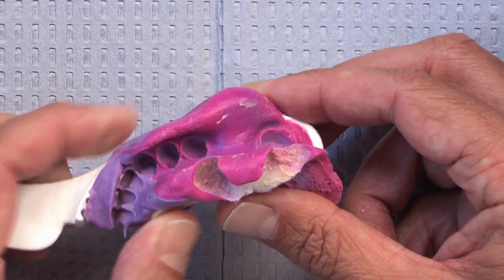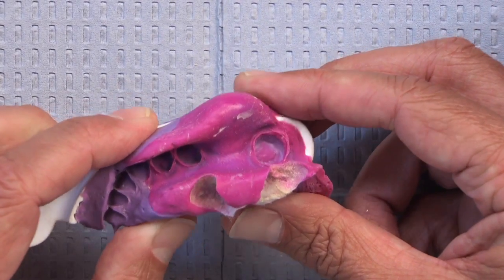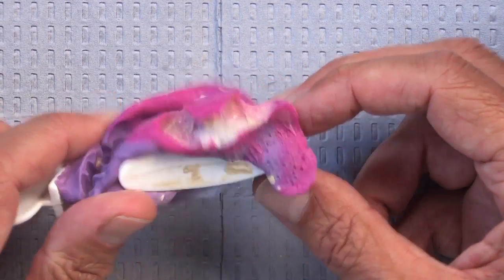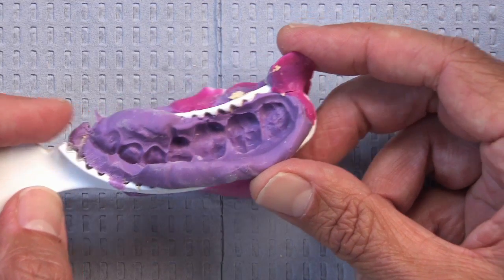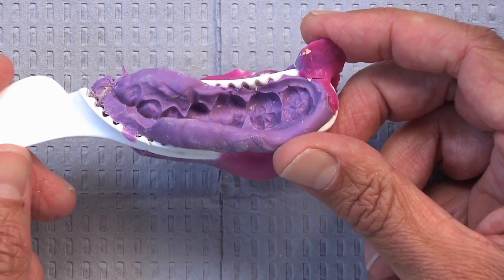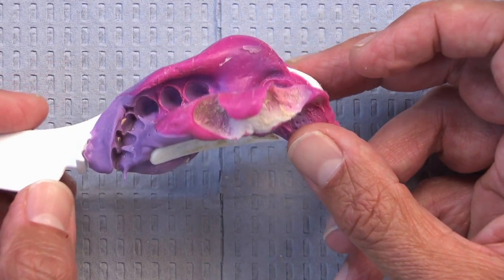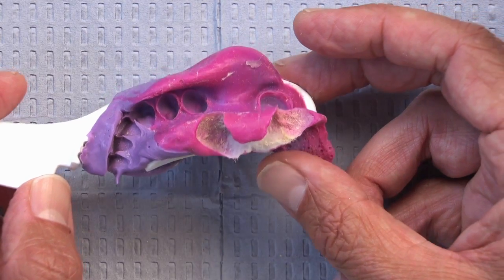We could talk about how much these plastic trays have a tendency to distort if you don't use a super stiff material on the inside. But it's really just the length, the span of this bridge, where even if the bite is perfect on here, it's going to be very difficult for us to do any excursions, and the bite sometimes is difficult on these bridges as well, and it's just not as stable as if this was taken in a metal full arch tray. That would certainly be our recommendation.